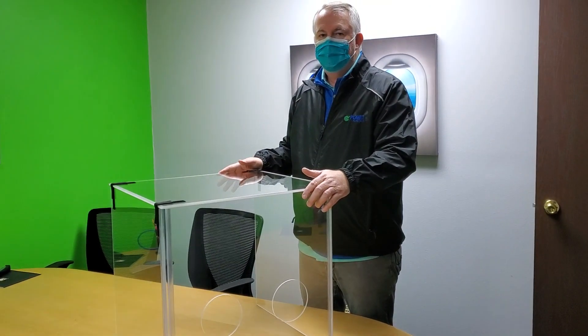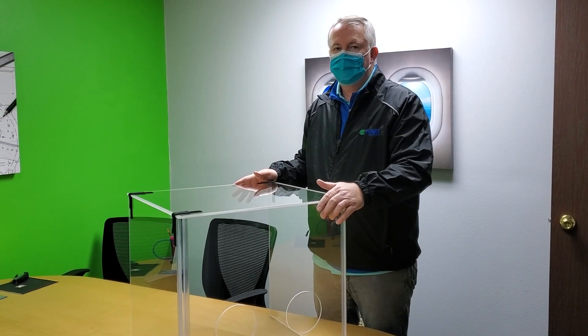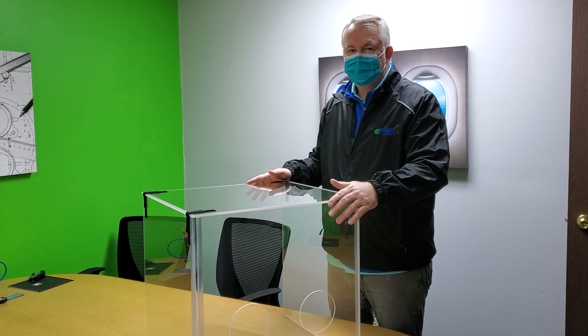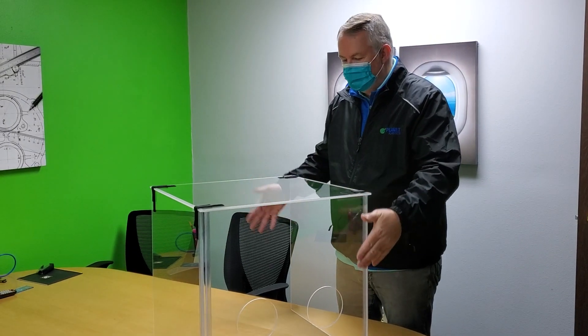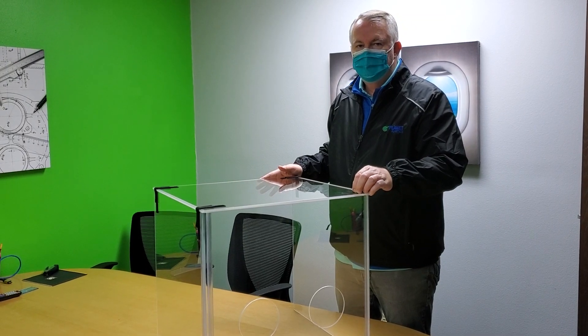Greetings everybody. I'm DJ with Planet Plastics. I'd like to take this opportunity to introduce you to our latest product, the Planet Plastics Portable Intubation Box. Right now I'm going to demonstrate how easy it is to disassemble and show you that it will pack in a flat space about the size of an extra large pizza box.